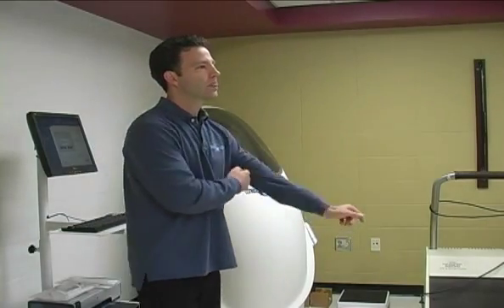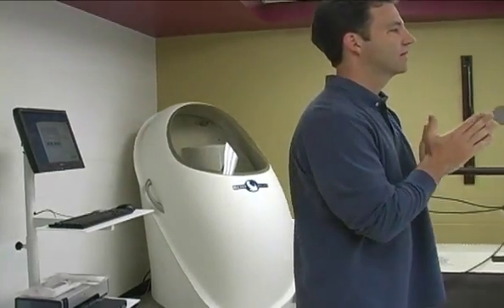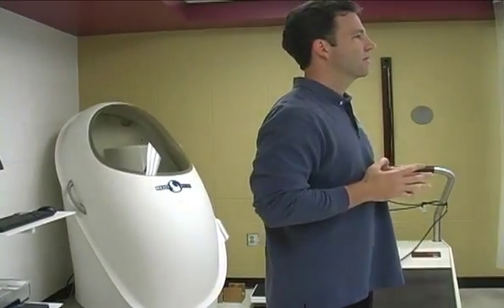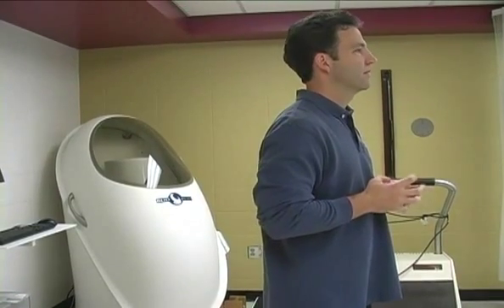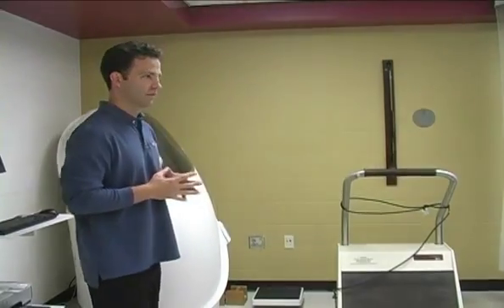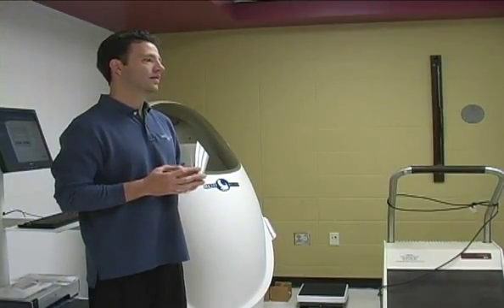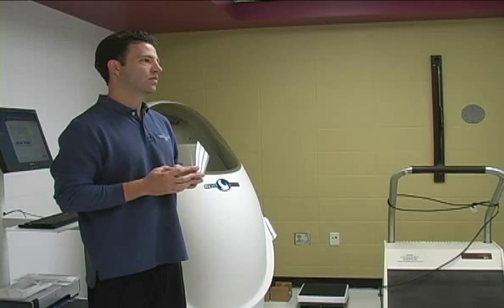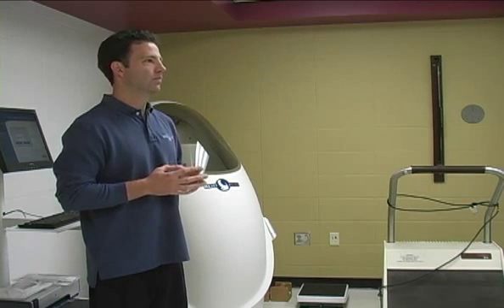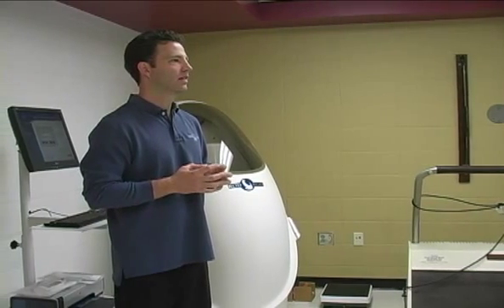The only downside, and it just depends on how much money you have, if we were to rank which one is the most expensive, we're talking one of the more expensive, even though you can get hydrostatic weighing tanks. Ours that we have in there is a kneeling submersion tank. It probably costs a little less than half of what it costs for us to buy this. So when we're looking at what method to use, some of it is what you have available to you.